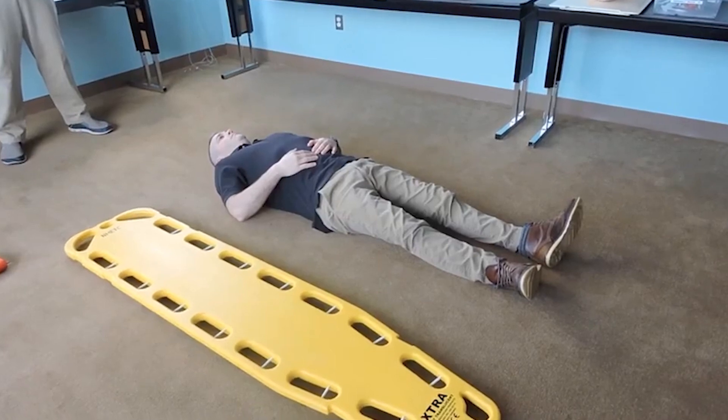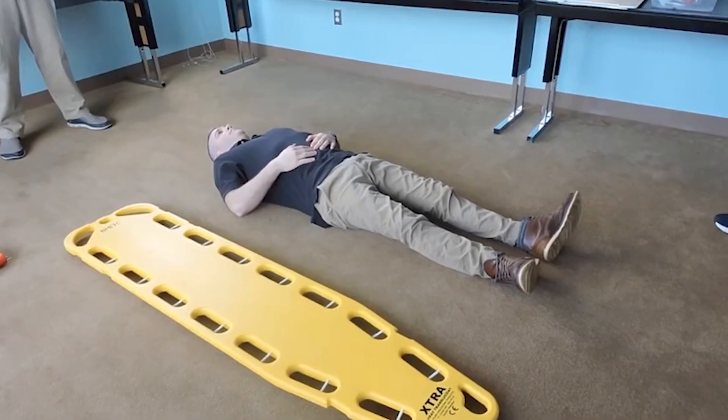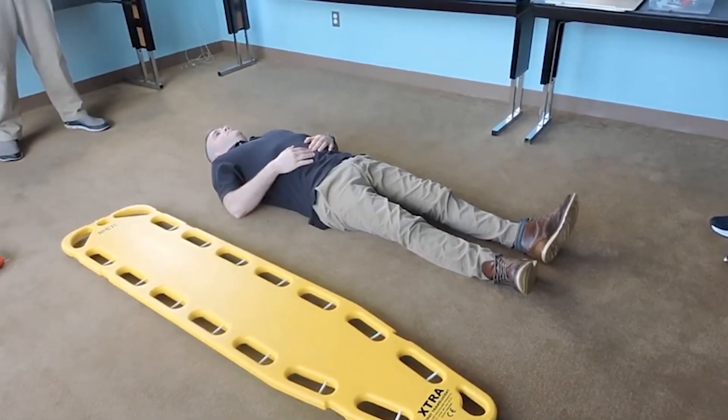You may place any materials you need adjacent to your patient. Before you begin, you may examine the equipment and assure yourself it's sufficient and working properly. Please tell me when you're ready to start. I'm ready, sir.